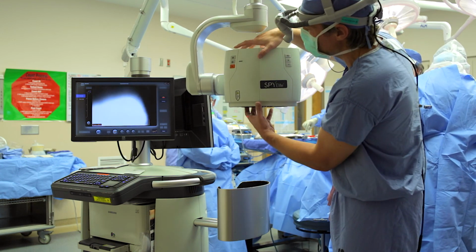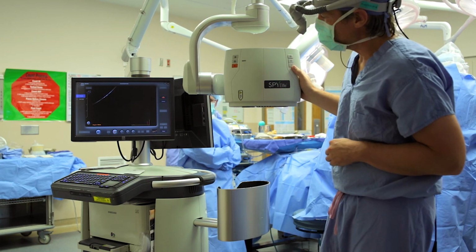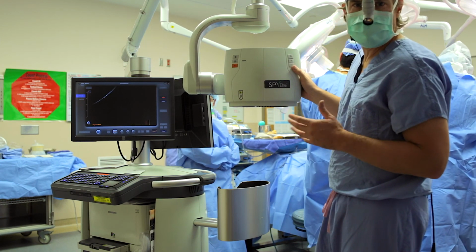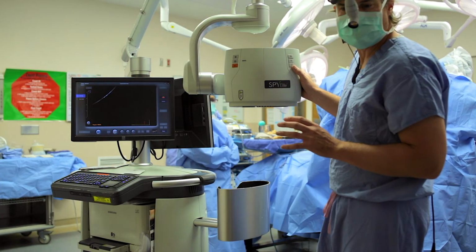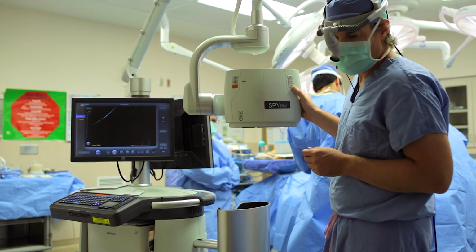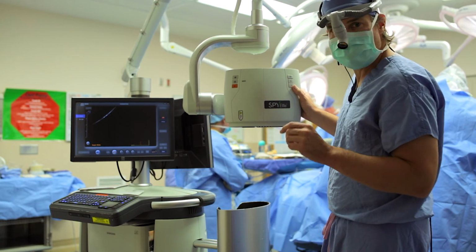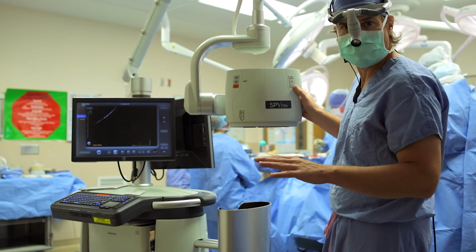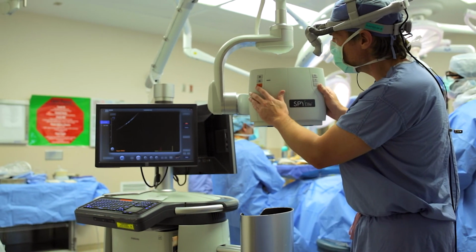So that's one image. And then the second little icon there, the second button down, it's a camera. You can use this to just take a still photograph. If you want to capture a still image and use that later, you can dump that in a regular JPEG format. Anyhow, in my opinion, you get much better quality photos here at the clinic if you call our surgical photographers. Okay, so that's the buttons you need to know about.